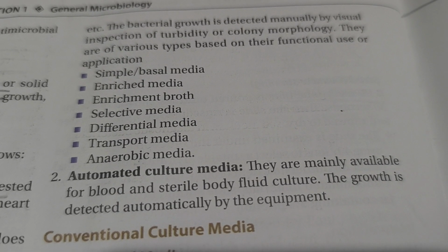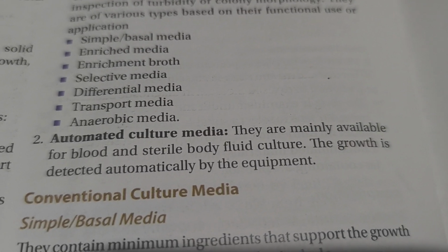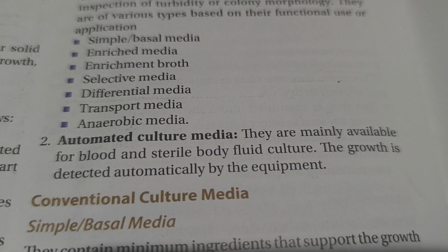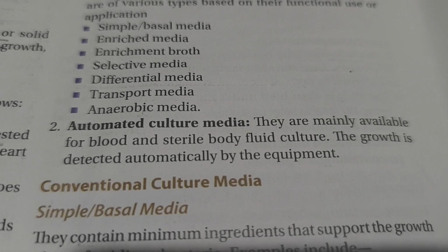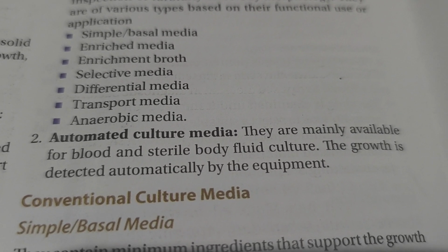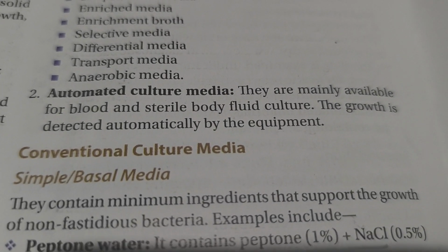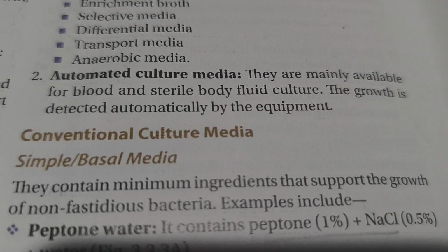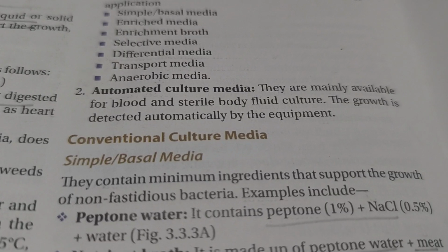They are of various types based on their functional use or application: simple or basal media, enriched media, enrichment broth, selective media, differential media, transport media, and anaerobic media. Automated culture media are mainly available for blood and sterile body fluids. The growth is detected automatically by the equipment.